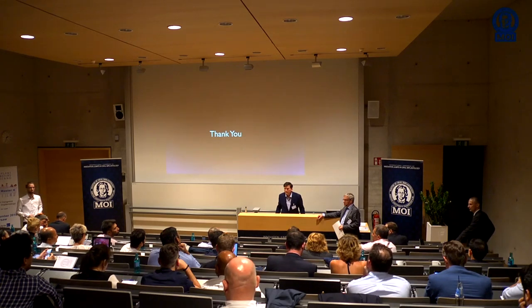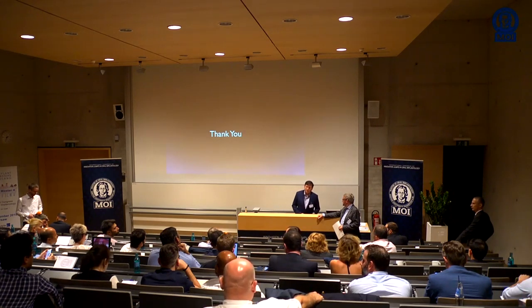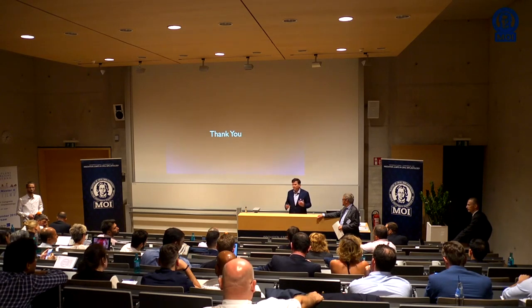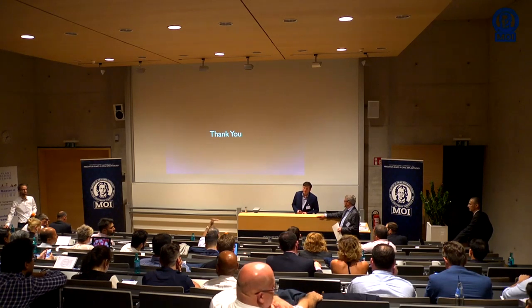How would you decide, before you do anything, how much bone you are going to cut out? Oh, as far as how much resection to do, I look at the smile line, number one, and I look at the restorative needs of the material. You're going to place your implant.